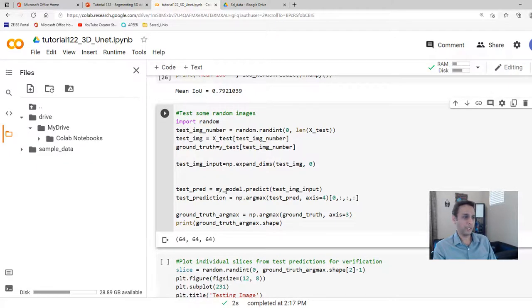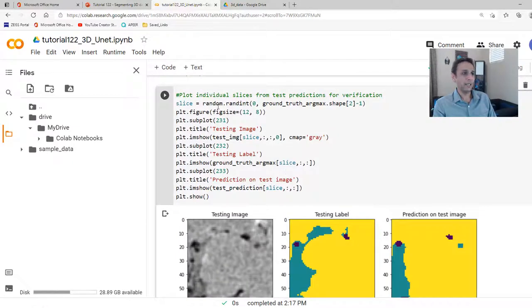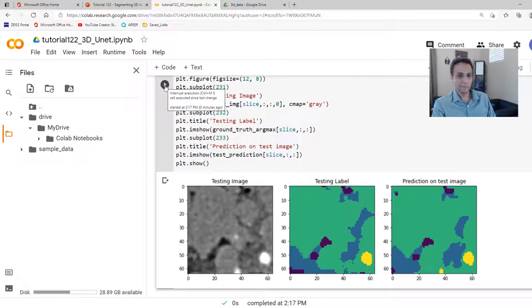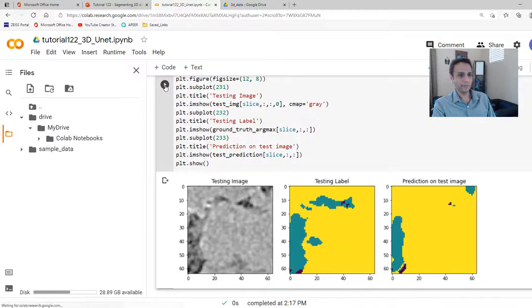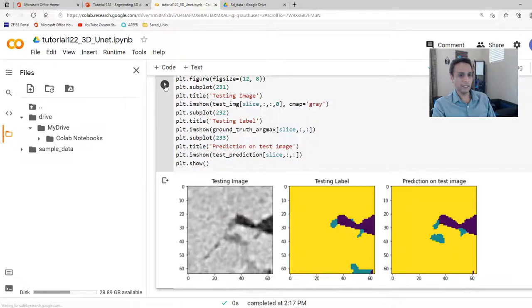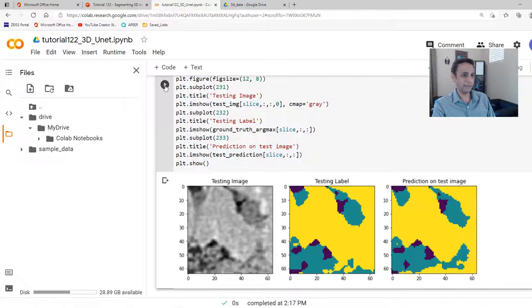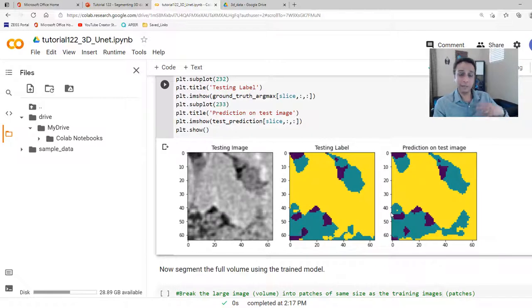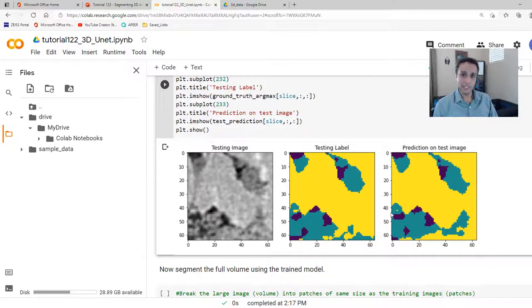Let's visualize by plotting a random 2D plane from a test volume alongside its ground truth label. Honestly, the prediction looks better than the label in some cases — the label marks something I don't see clearly in the image. Plotting another example, the prediction and ground truth are almost identical. You can see how straightforward it is to perform 3D U-Net segmentation.